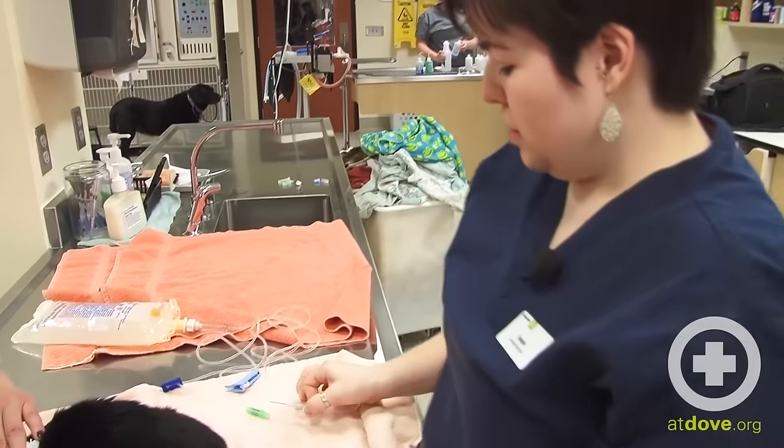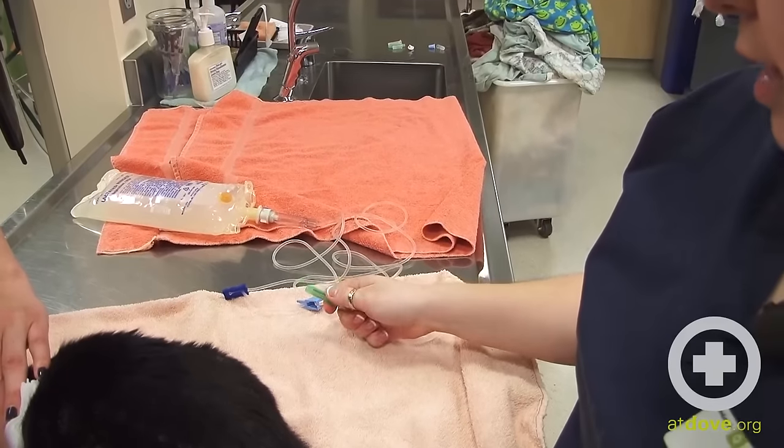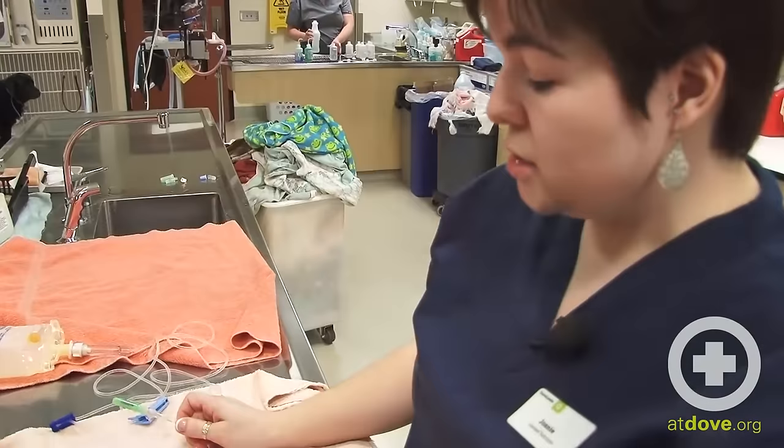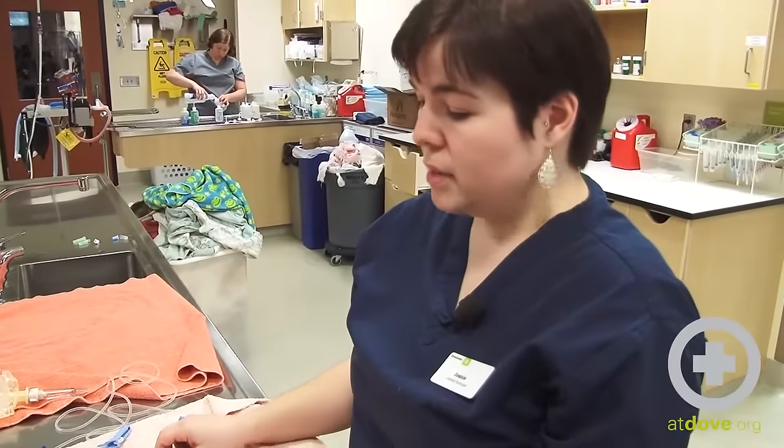With the needle, you want to put the cap back on not towards your hand but against a table. We generally leave the dirty needle on the bag of fluids so that we know each time we go to give fluids we put a new needle on and don't assume the one already there is clean.